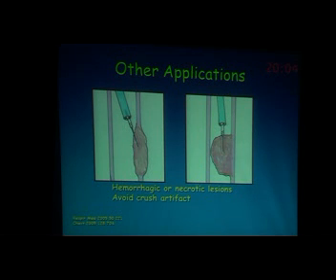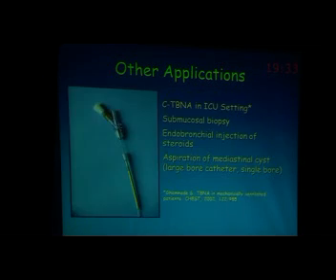And when the tumor is very necrotic, maybe you have experienced it, you get a big biopsy and the pathologist says, no, non-diagnostic, necrotic, do it again. And then you do it again, because, you know, the patient may not accept it. So when the tumor is necrotic, you can again go into the core of the tumor and get viable, better tissue. And again, when there is crush artifact, TBNA does not cause crush artifact. If you try to avoid crush artifact when you are getting biopsy, use TBNA.